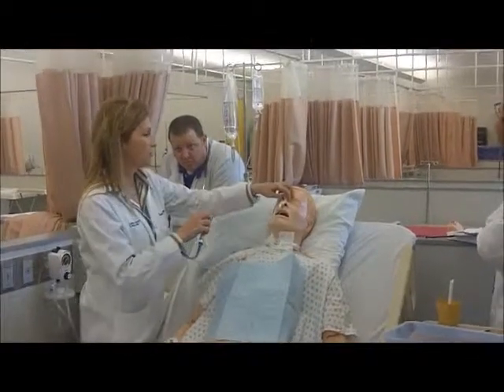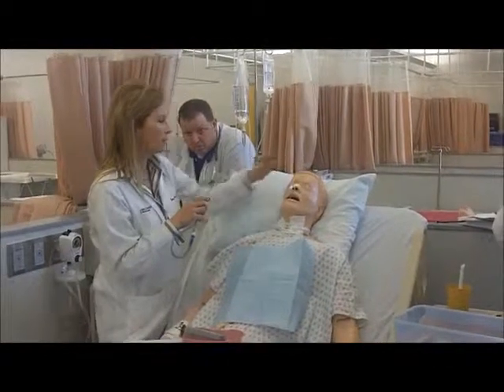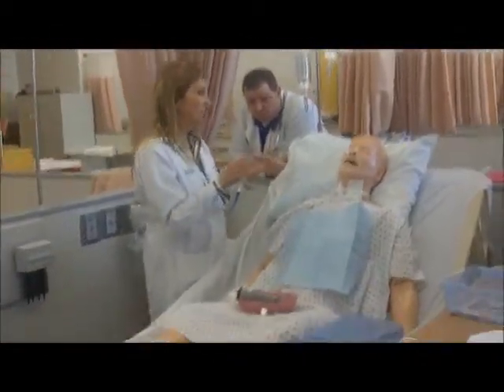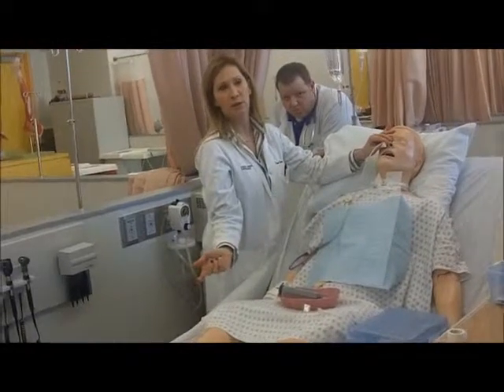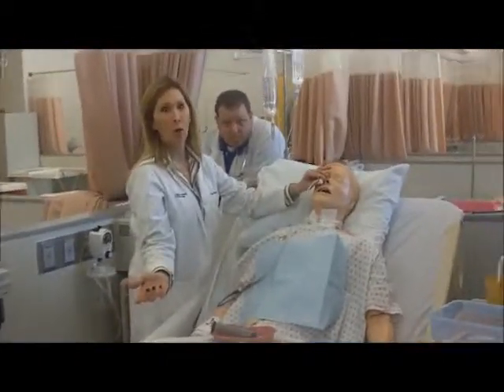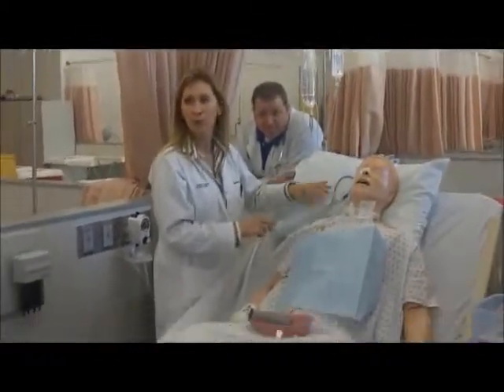And you say, okay, Mr. Smith, close your eyes. You wanted this tube out. Guess what? Now it's finally coming out. Don't worry. It's a lot easier coming out than it is going in. So you're going to take a deep breath. All right, Mr. Smith, grab my towel here. Once continuous motion, it's out. It's a lot easier than it coming in. Oh yeah, just be careful, nothing flying out of the end. We'll just tell them to close their eyes when taking it out.